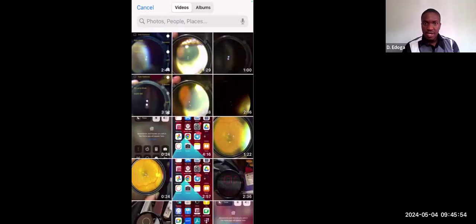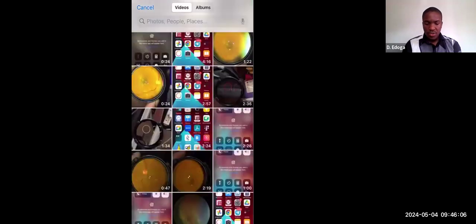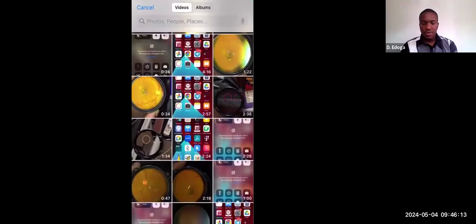All right, so I'm showing my screen now. I want to rush because I just have about 5 more minutes before I take questions. So you could see the videos. Let me select this video. It shows you this display where you have cancel, you have choose. So you just choose it. The problem that this app has is that it compresses this video.